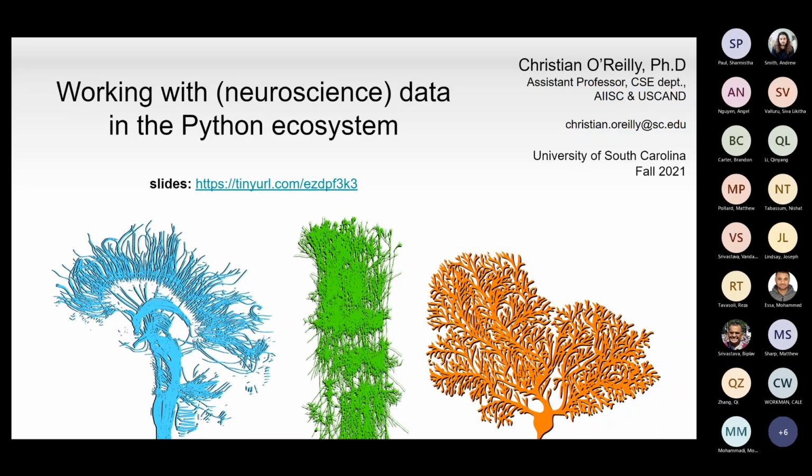I'm really happy to have the occasion to give this talk because that's a topic that is really of interest to me. It's something that I really enjoy doing, some data wrangling. I put neuroscience in parentheses in the title because 80 to 90% of this talk is about how to get data, how to analyze them and how to put them in proper format. There's a little portion that is specific. I take a use case with EEG recordings, but people that are not working with neuroscience data specifically will find that most of this talk is still useful to them.